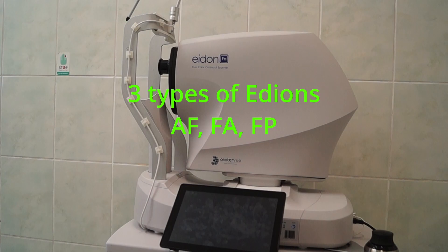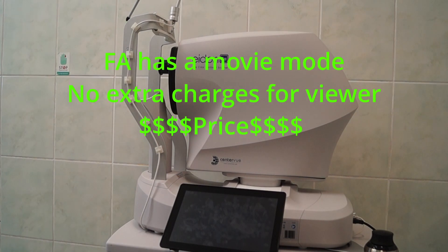Another feature is that there are three versions of Adon, so you're not wasting money on what you don't need. The fluorescein angiography version has a movie mode, there's no extra charge for the viewer, and last but not least, this is very accessible in terms of price — it doesn't cost you an arm and a leg.